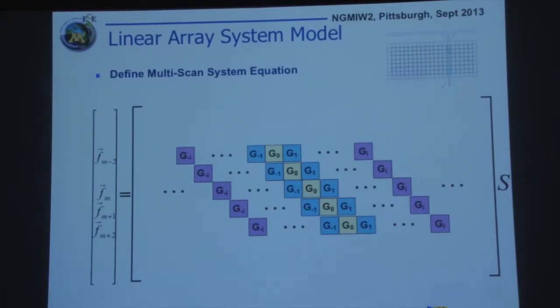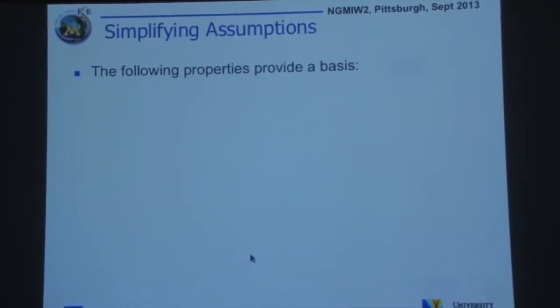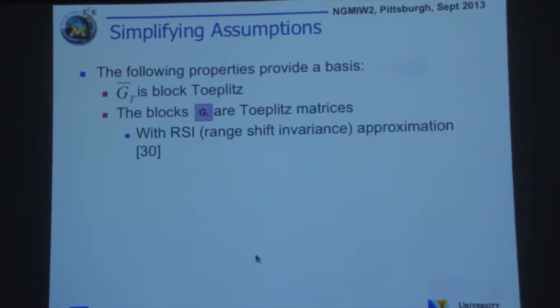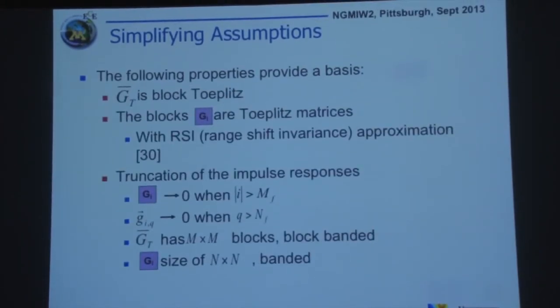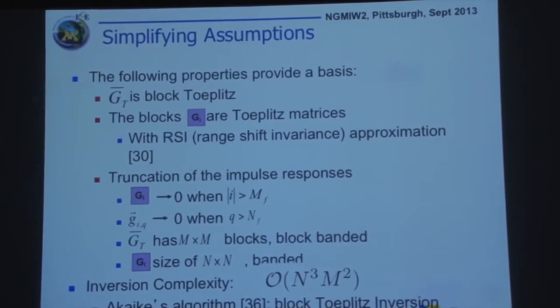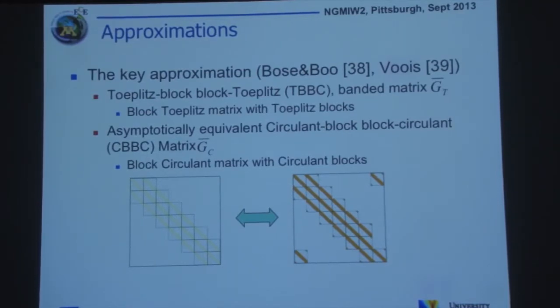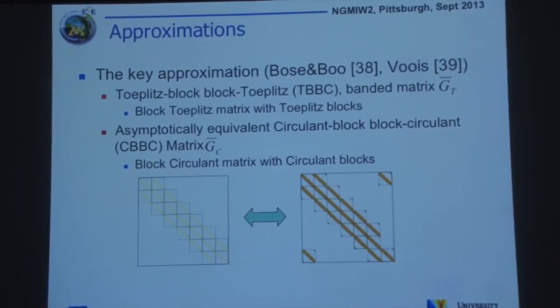I may have some numbers in terms of the need for solving this problem. Just if I can convince you that the size of this matrix is very large to solve, but what we have been able to do is to use a property of this matrix. This is Toeplitz, but because of the large size of the matrix, it actually approaches a circulant matrix.